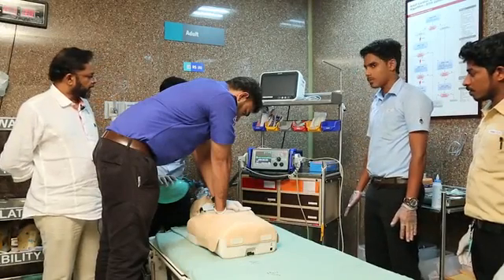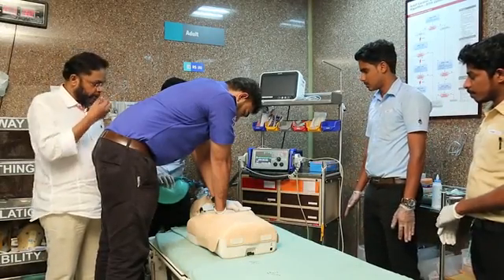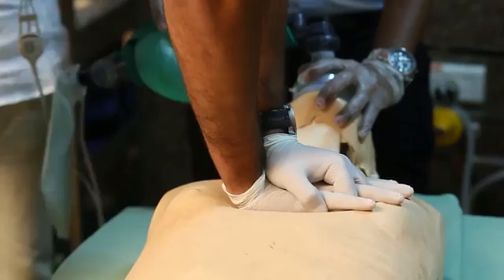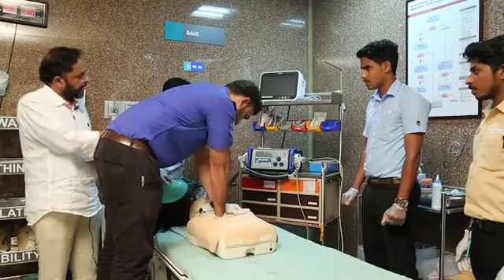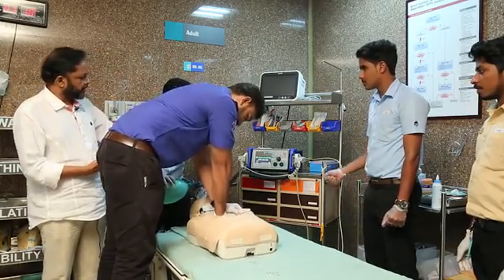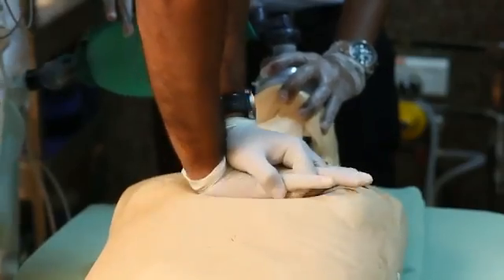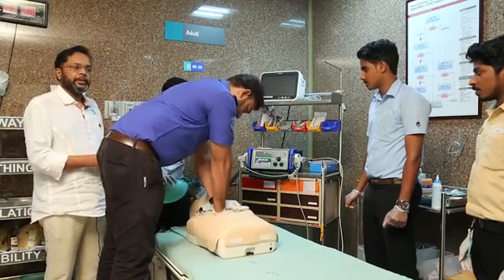This is a case of sudden cardiac arrest in the emergency room, and active CPR is going on. We attach the monitor and the monitor shows that there is ventricular fibrillation.